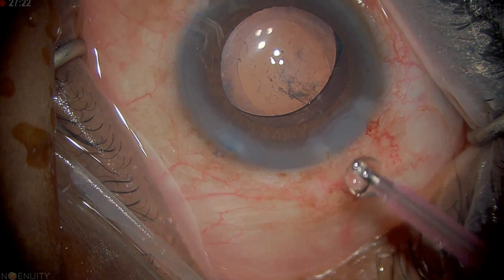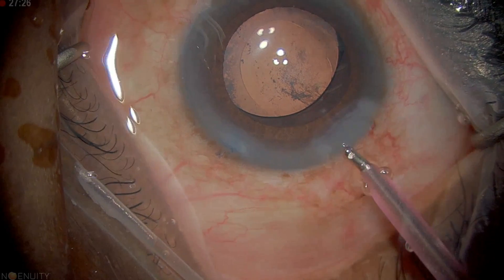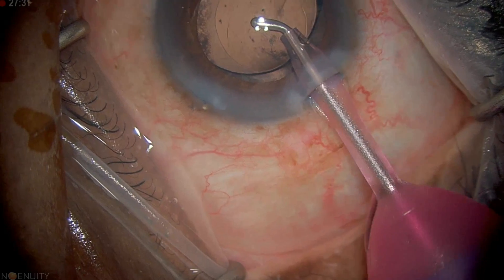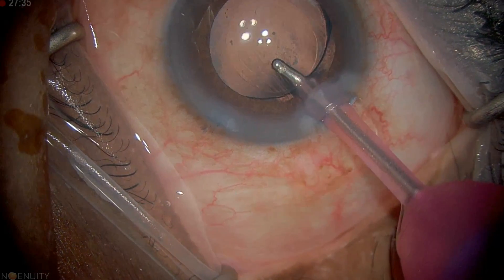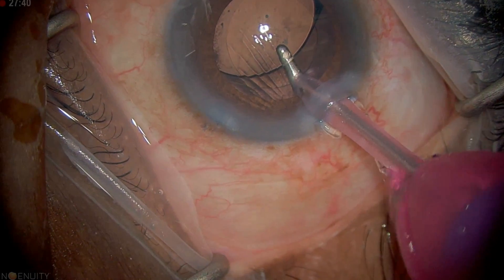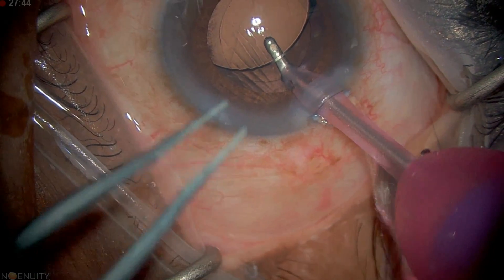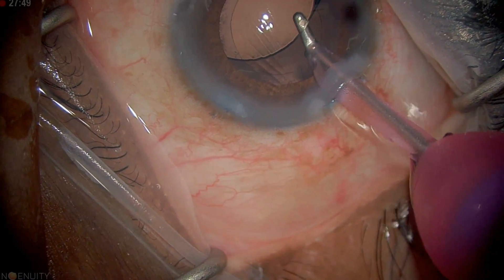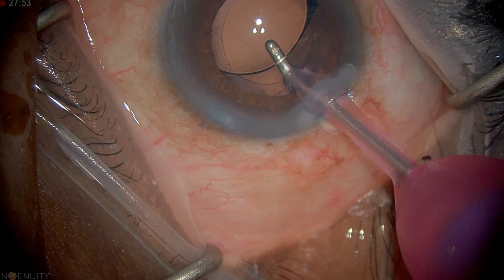I'm going to use the irrigation-aspiration tip to remove the viscoelastic. Sometimes just putting the tip in and irrigating is enough — look at all the viscoelastic starting to come out just from irrigation. Then we'll aspirate. I like to get underneath the lens to remove the viscoelastic from underneath. As long as my port is facing the endothelium, I'm safe — I'm not going to engage the bag.